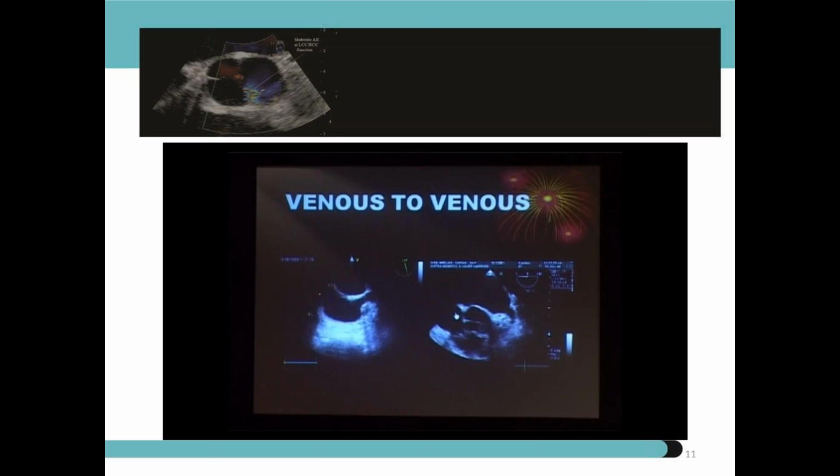The other view here is the short axis aortic valve, the mid-esophageal aortic valve short axis view, also called the Garland or the wraparound view. Now this view tells you about the aortic valve en face. This is the aortic valve. You can see the three cusps of the aortic valve. This is the RA, this is the RV, and you have the tricuspid valve here. And here you have the LA, and you have the RV outflow here. This is the position of the pulmonary valve. So you have the RV inflow with the tricuspid valve, the mid RV cavity, the RA cavity. This is the lower half of the interatrial septum, and you have the pulmonary valve with its outflow tract here.